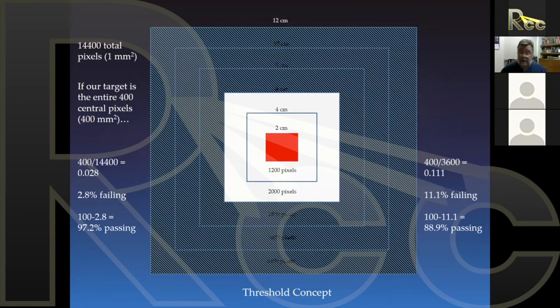But it is good to use this process to evaluate the high and low dose gradients, as I'll show you in a moment, high and low dose regions for every case. And I'll show you that in a moment.